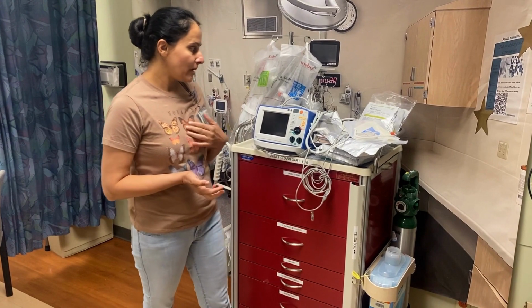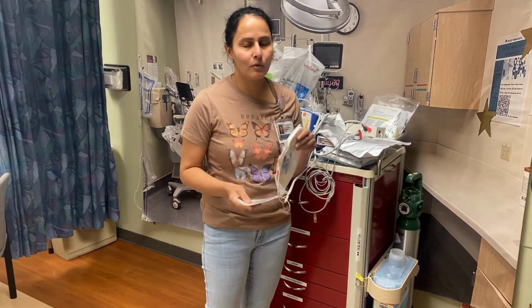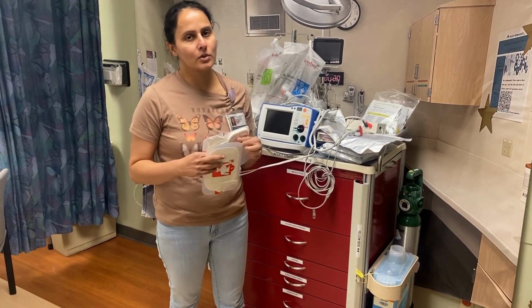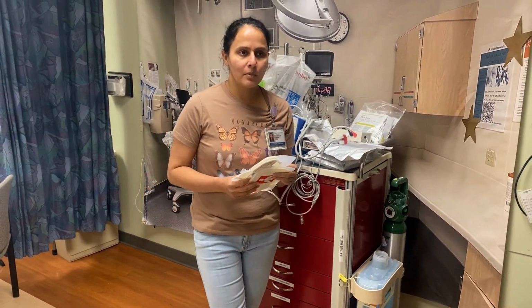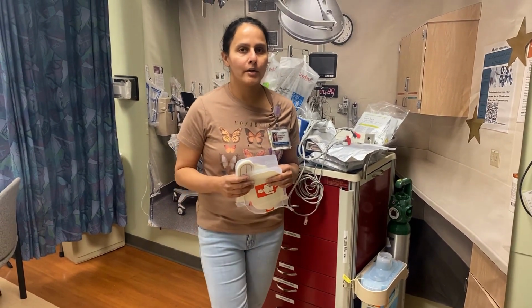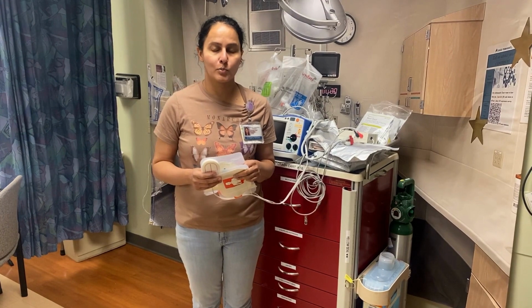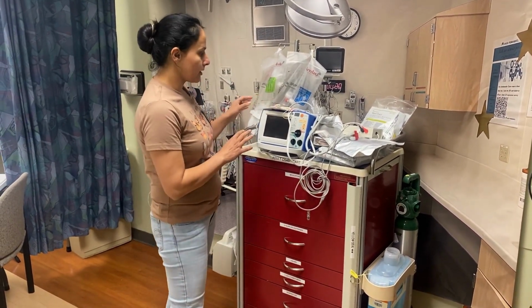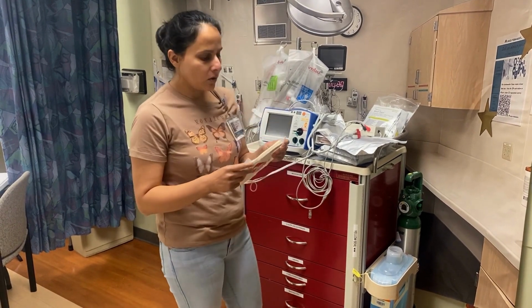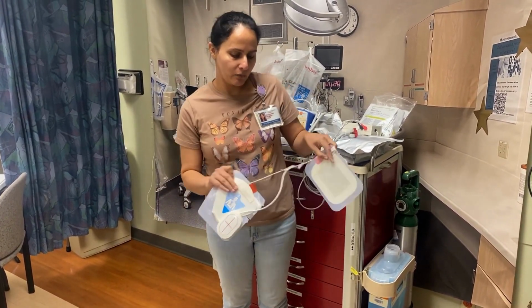For these patients, transcutaneous pacing can be painful, so ask your doctor to order some pain medication. When you first see the patient, you bring them into the room, undress the patient, make sure you put them on a cardiac monitor, get 2 large bore IVs, and then you're going to put them on a crash cart monitor, that's Zoll.